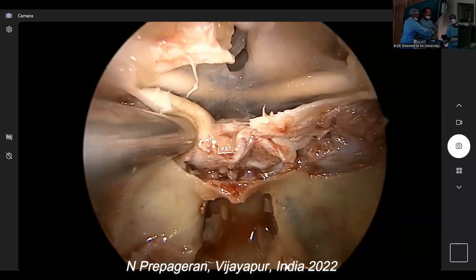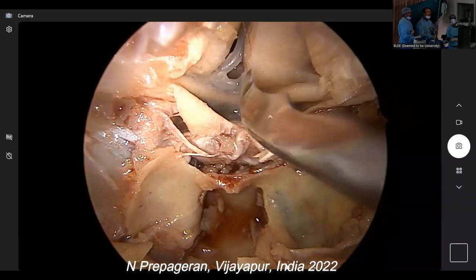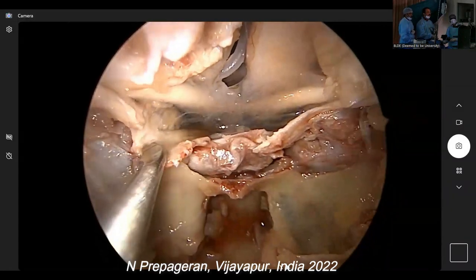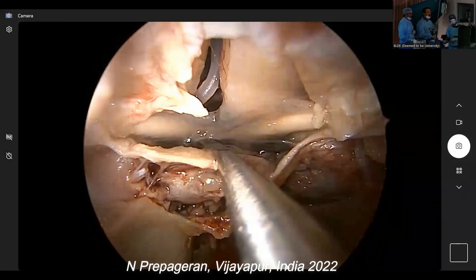Clear. Hold on. Can you see? There, guys, can you see? Ophthalmic artery. Having done that, I can already see the ACA. Okay, so now what we're going to do is remove the arachnoid along the optic nerve.